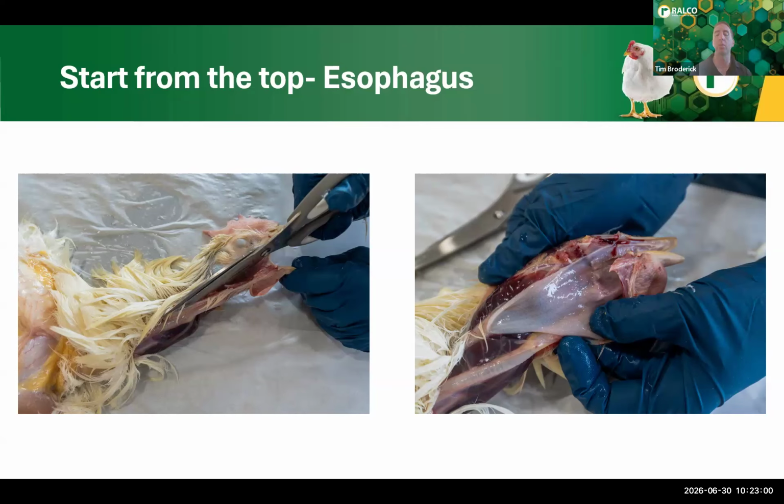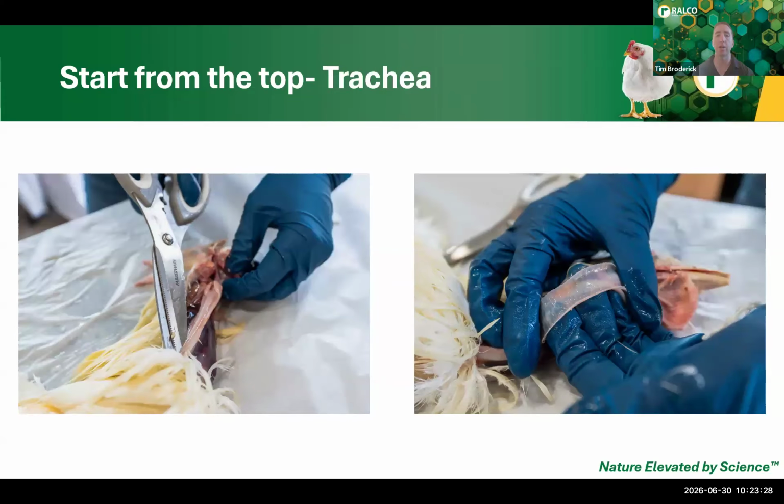So within the esophagus, what are we looking for? We're looking for pretty much the same thing we see within other mammals and people, is consistent coloration within that tube, even lines for that peristaltic movement down into the crop, absence of any types of mucuses, blood, or discolorations.